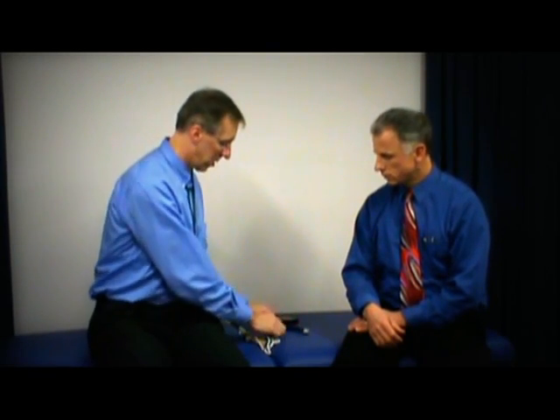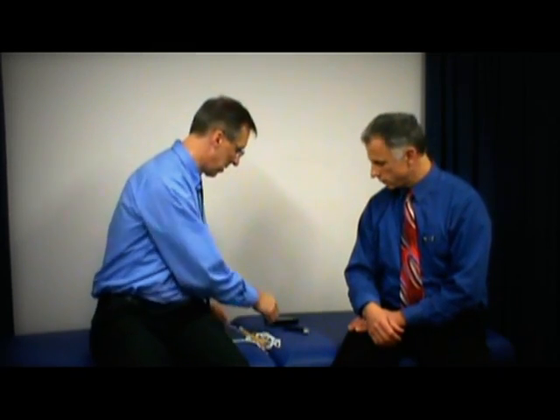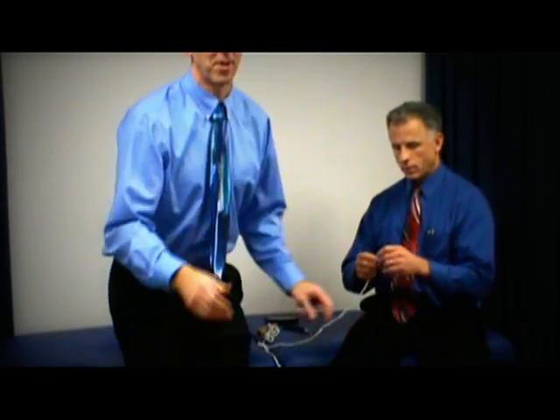Yeah. Oh, really? I just bought one because I made one for my brother-in-law. So this is a cheap pulley, there's almost like plastic in there, but what you're going to do is the pulley is going to have a little loop on the top, and you can actually loop some nylon rope through there. Mm-hmm. And what happened to my scissors? Oh, there it is. Oh, don't throw that. No, it wasn't.